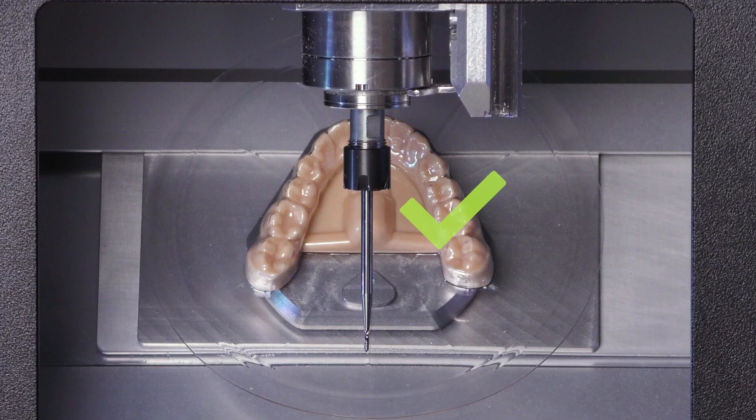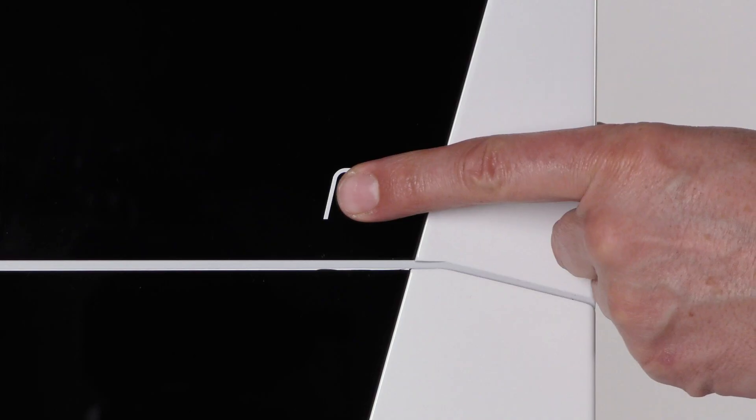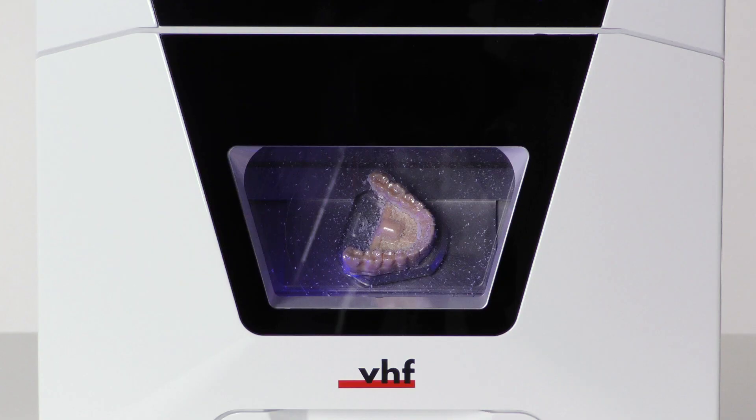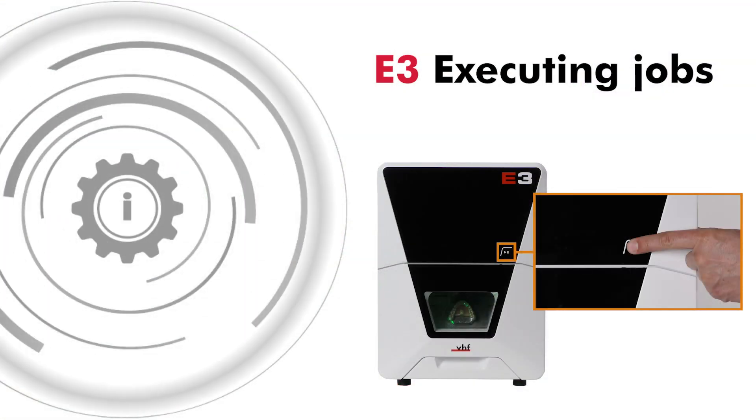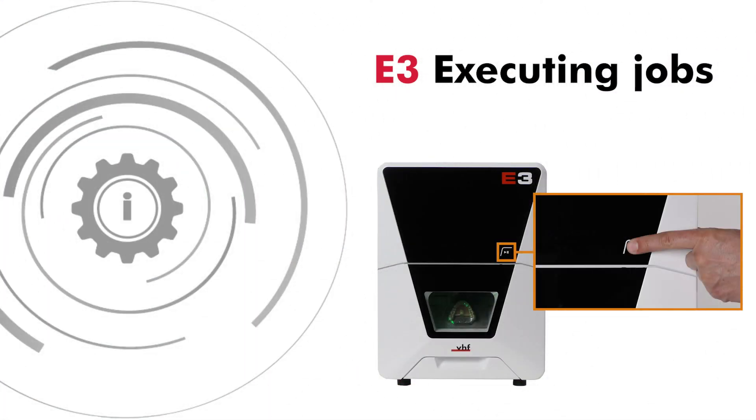In this video, we will show you how to start and abort jobs with your E3. You control the machine mainly with dental CNC. We will give a brief overview, but for further details you can find a link to the relevant help article in the dental CNC manual in the video description.